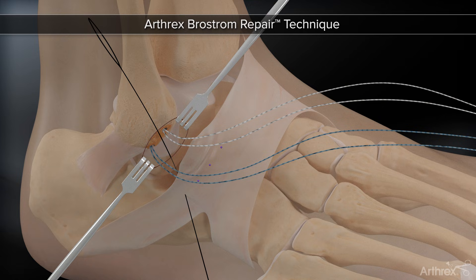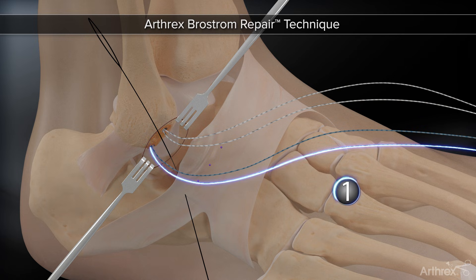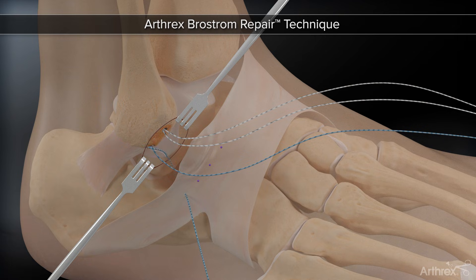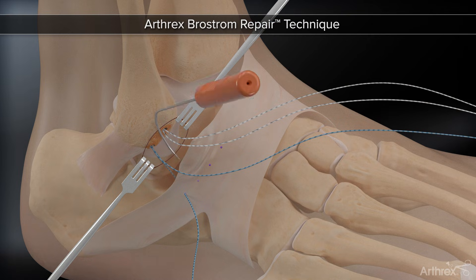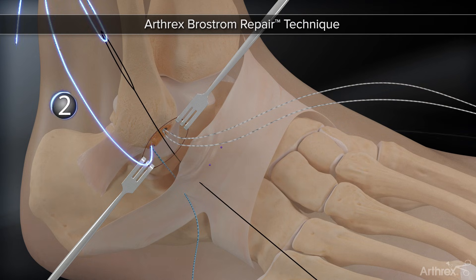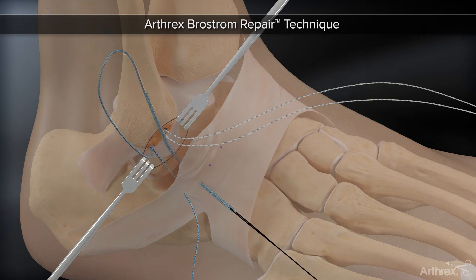Proceed the most inferior suture through the proximal loop of the suture passing wire, and proceed to shuttle the suture through the torn ATFL and extensor retinaculum. This process is repeated with the remaining three sutures, ensuring that each suture corresponds with the appropriately identified exit point on the skin.